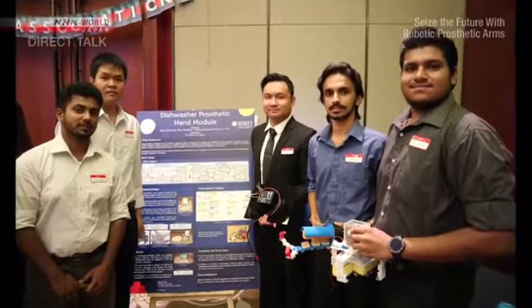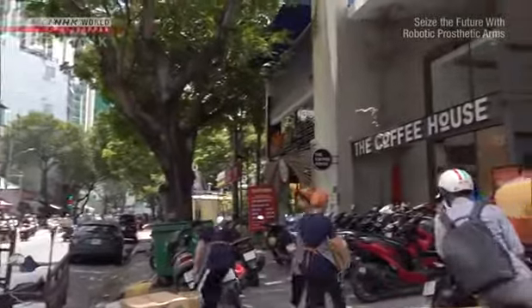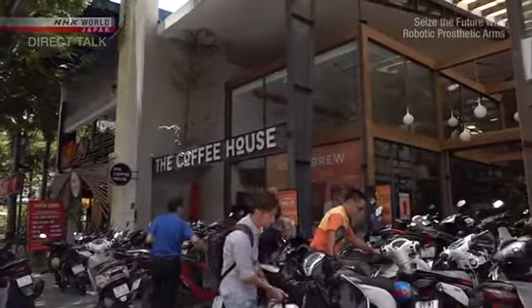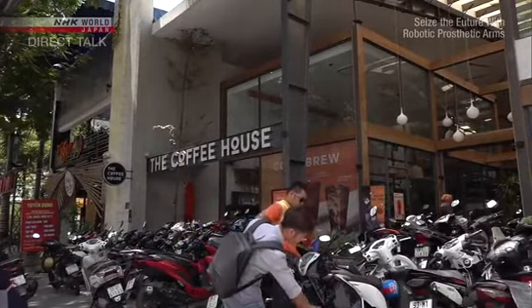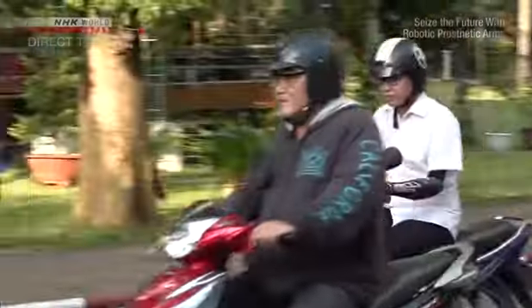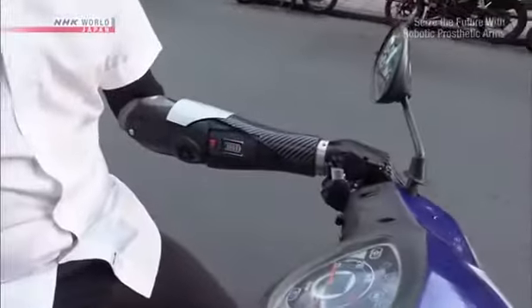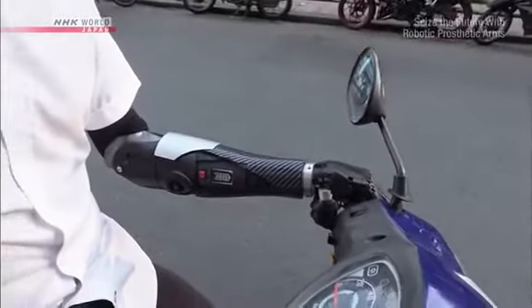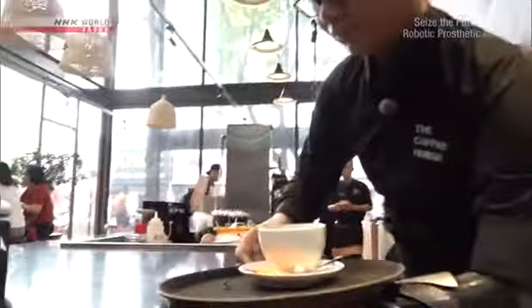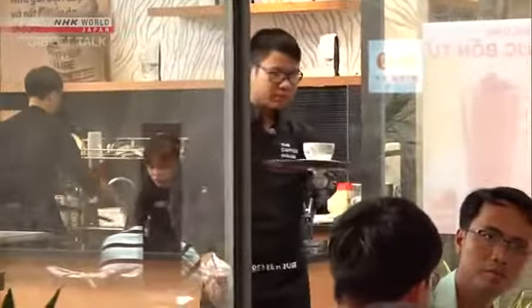The students feel like what they do in their university is actually create value for society. Ha's company also partnered with one of the largest coffee chains in Vietnam and started a project that will provide job opportunities to 30 amputees by the end of the year. Dua, who had lost one of his arms when he was 6 months old, is now a member of the team developing the prosthetic arm at Ha's company. At the coffee shop, he will wear the waiter module to test and see if he can bring coffee to the customers and clean the table properly.